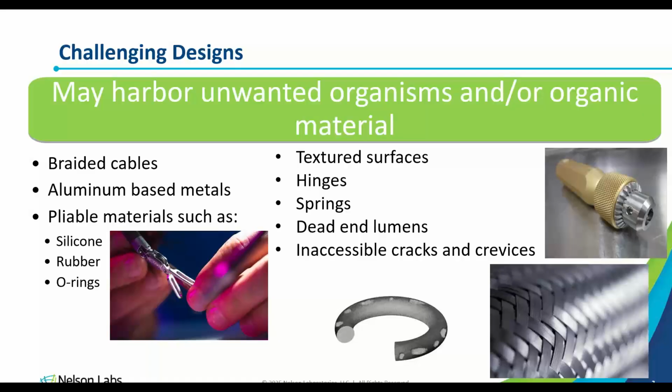Yeah, so that's an excellent question. For reusable medical devices, bacterial endotoxin testing is no longer recommended per AAMI ST98. That's the cleaning validation standard here within the US. And that does not list bacterial endotoxin testing as an endpoint during your reprocessing validations.